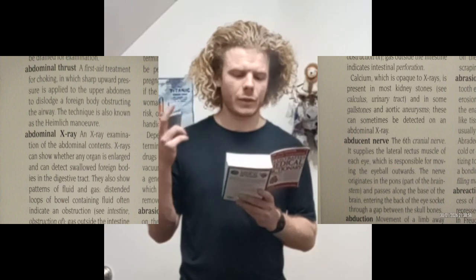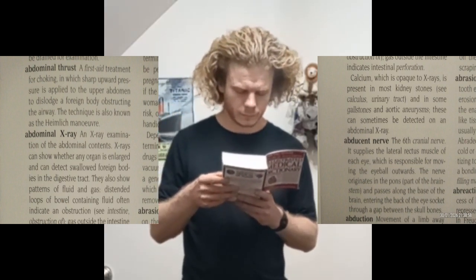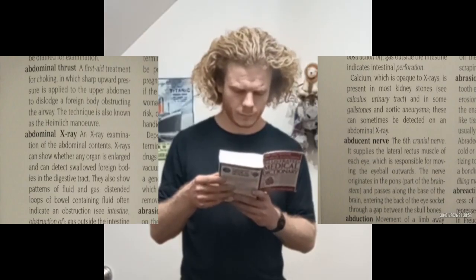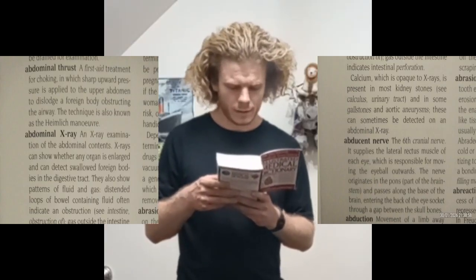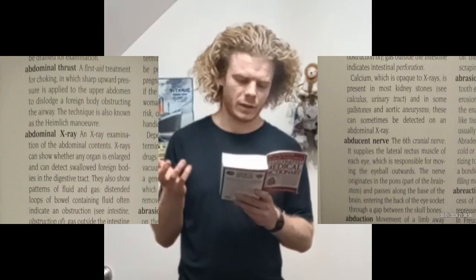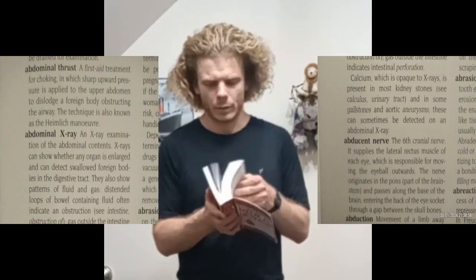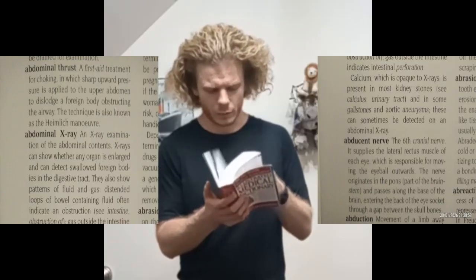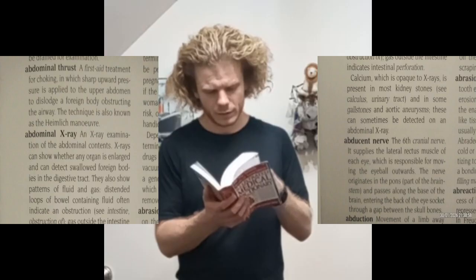They show patterns of fluid and gas. I don't know what the word distended means. And that way an obstruction of the intestine can maybe be found. Let's take a look at perforation, but I think it's just what it says.